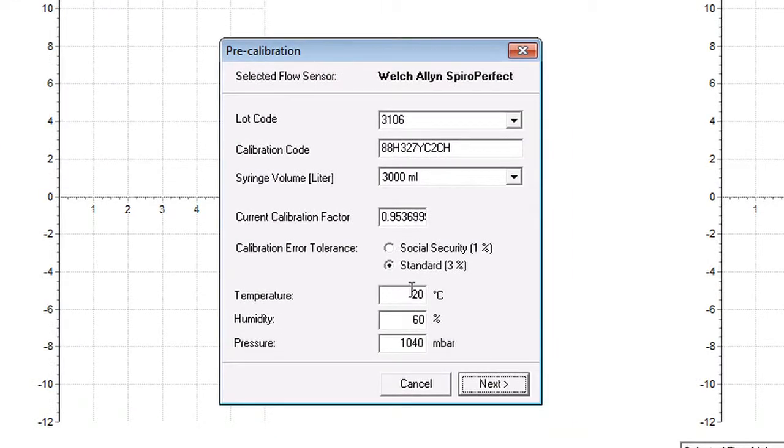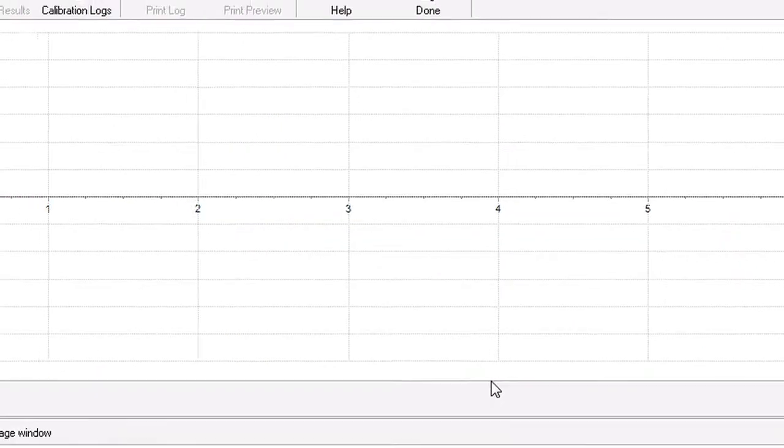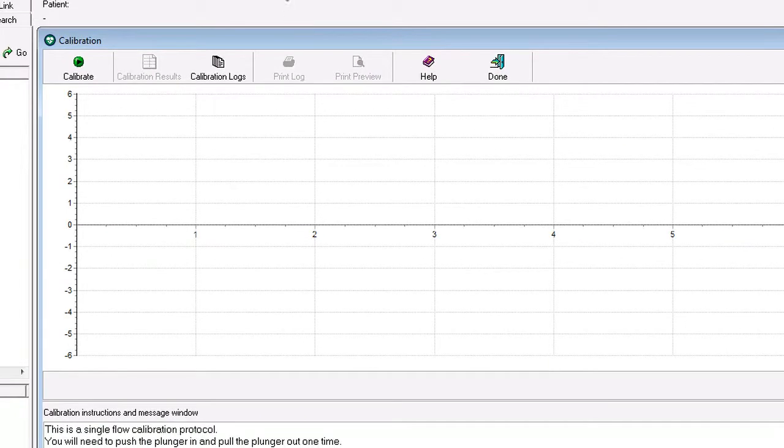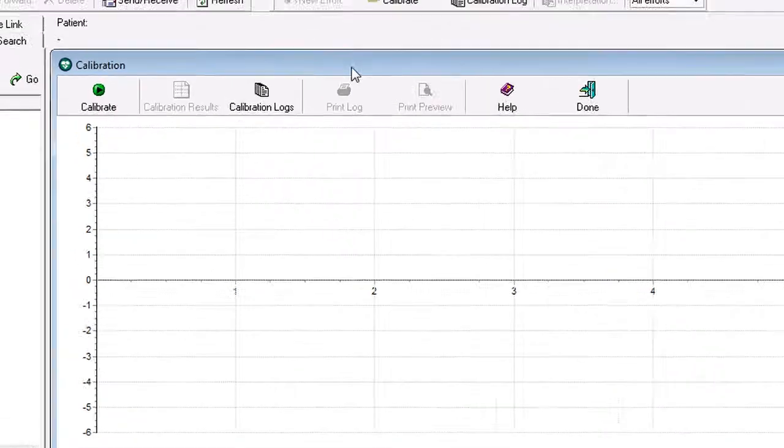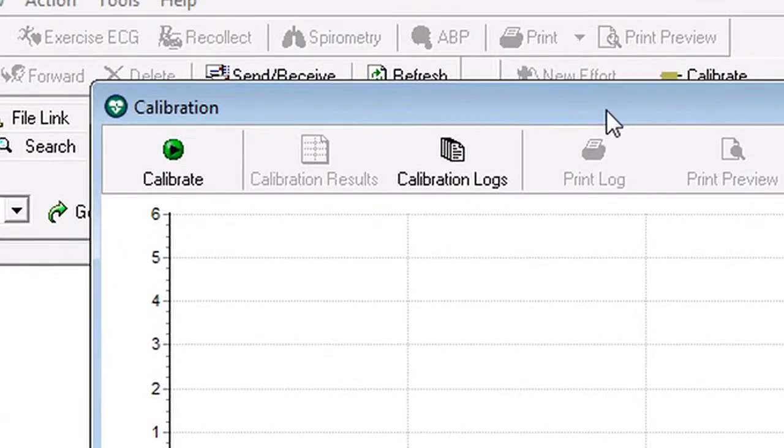When you've filled in the fields for temperature, humidity, and pressure, click on next. And when the calibration window appears, click on calibrate in the top left hand corner of the screen.